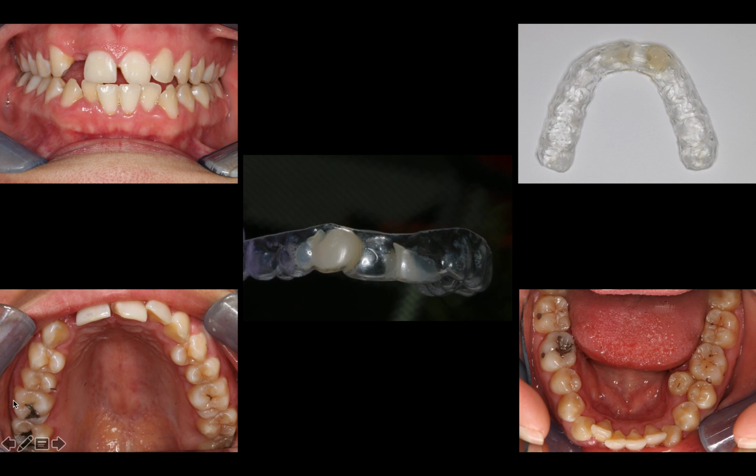So here, again, we did number 3, occlusal lingual, number 14, occlusal lingual, number 15, occlusal, 17, 18, 19, occlusal, and 19, buccal class 5. And we did all 4 of these restorations in one appointment and these 3 in one appointment. So a little bit of quadrant dentistry here.